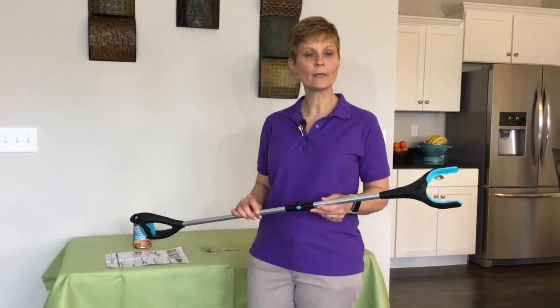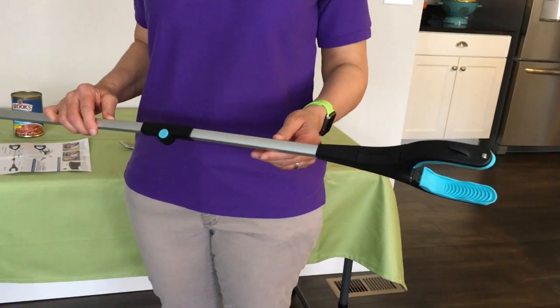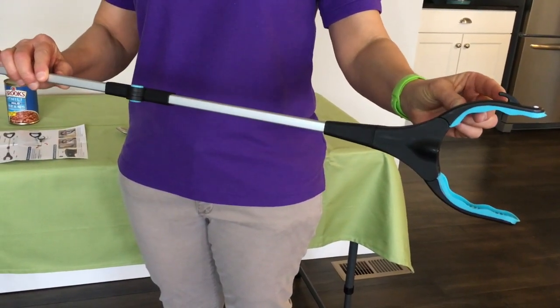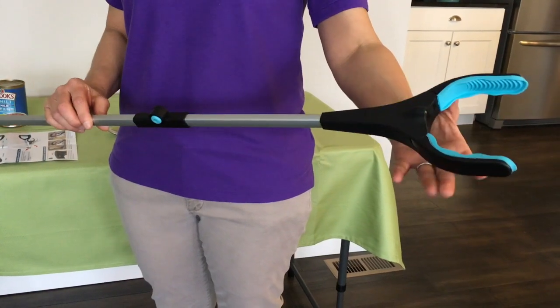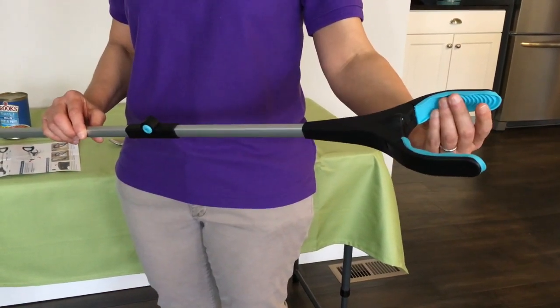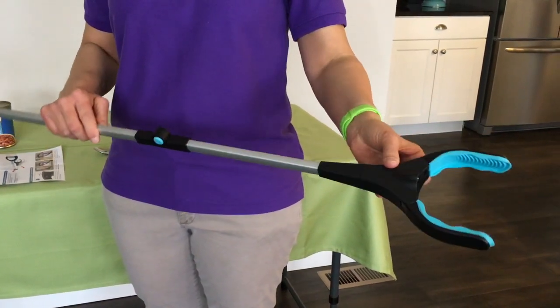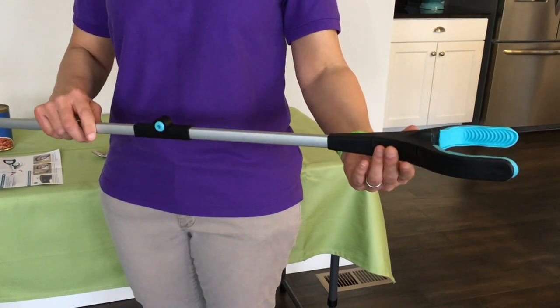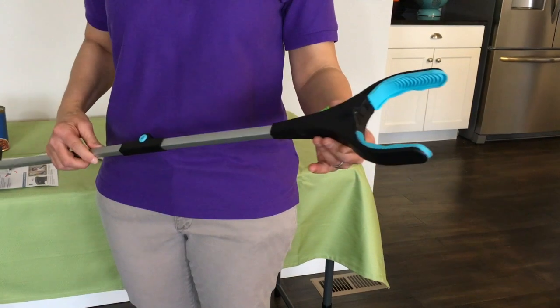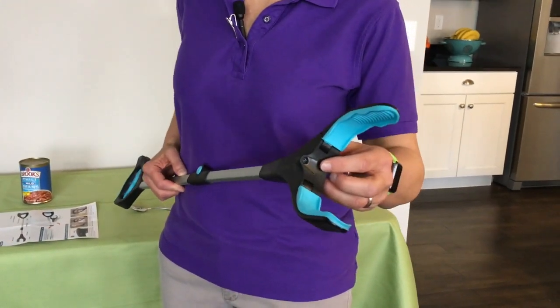So we're going to start here at the end of the reacher. On this one in particular, it has a magnet right here on the very end. It also has a hook. These are the grasping arms here and they're lined with a rubber surface. Now the grasping arms down here can be used in two different ways — they can be used horizontally like this, or they can be turned and used vertically. Inside the grabber arms, there is a small light right here, a little flashlight.